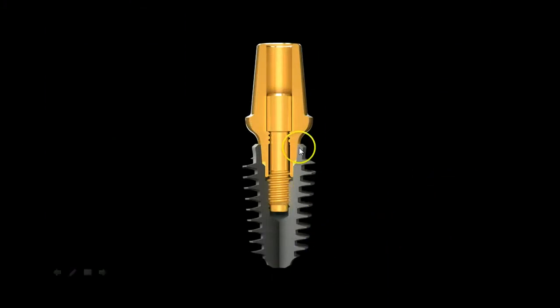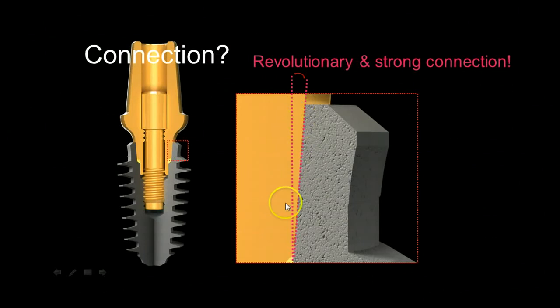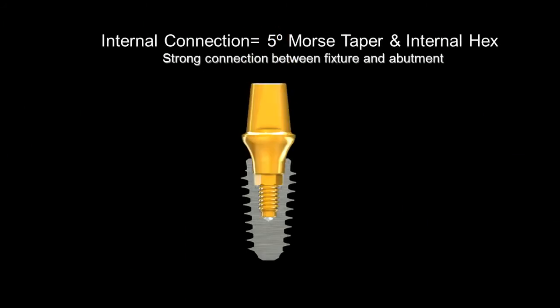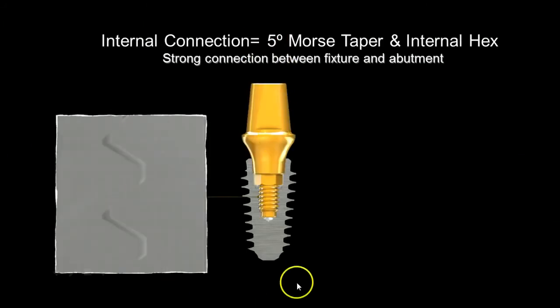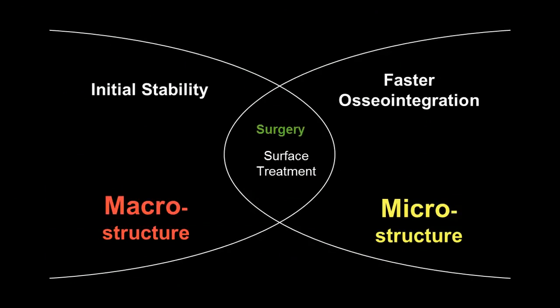Again, here is your internal connection there, and there's how it seals up against the implant, and there's your screw. One thing to note, notice there are threads here and here. So there are actually threads in the abutment. So once you remove this screw from the actual implant, then with your driver in place, you also have to lift up and unscrew the screw from the abutment as well. Remove the screw and then put your abutment removal tool in here, and I'll show you that in just a second. But here's your connection there. It's revolutionary strong, and again, you do get a perfect hermetic seal around that, clearly. All right. So with your abutment in place, again, you do get a cold welding effect clearly, and it is a very definitive connection.